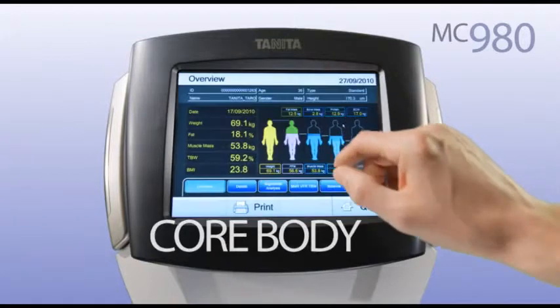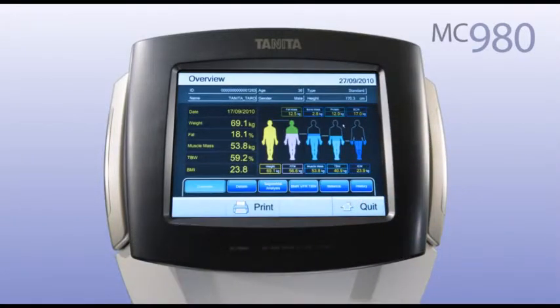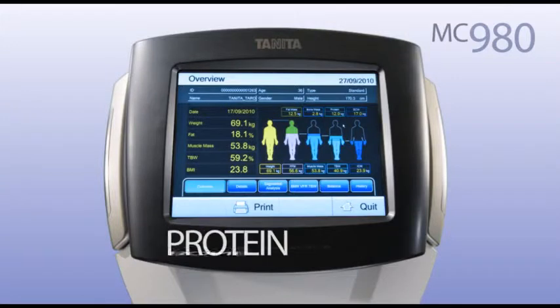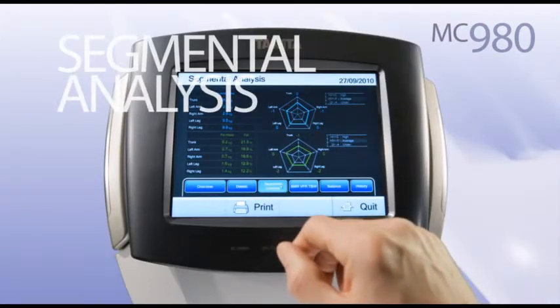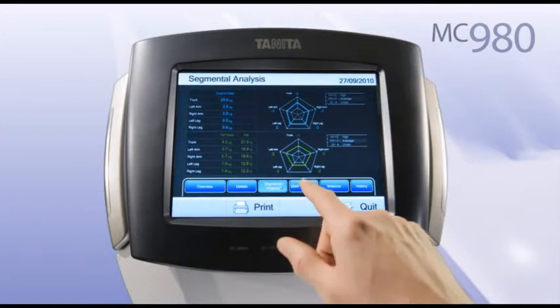An overview of core body composition readings including body fat, muscle mass, bone, protein and body water. Segmental analysis showing readings for each arm and leg and the trunk area.